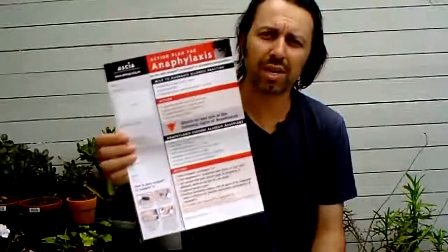So we'll take it out of its packet. The Anapen comes in two particular doses — one for juniors and one for adults. I'll point out that everybody who has anaphylaxis should have an action plan. The action plan your allergist supplies will be specific to your particular adrenaline device. So if you're using the Anapen, make sure you have the Anapen action plan; if you're using the EpiPen, you'll have the EpiPen action plan.